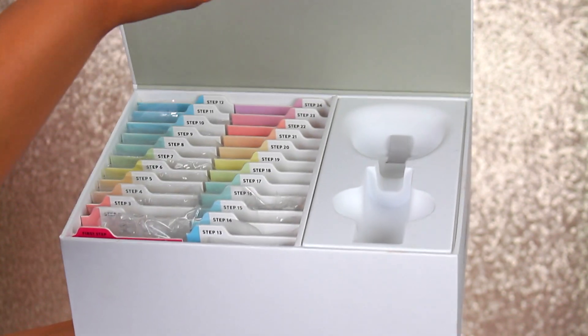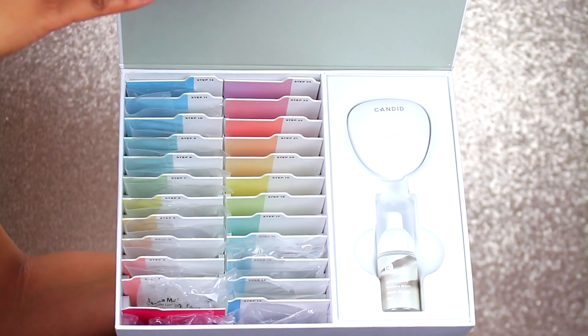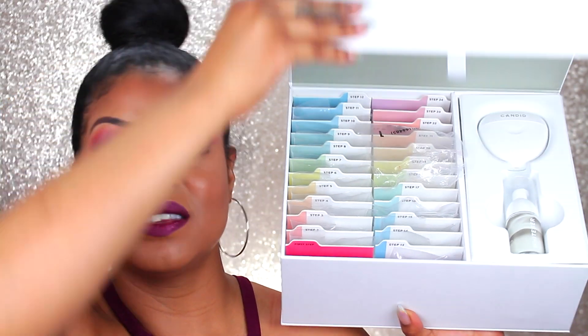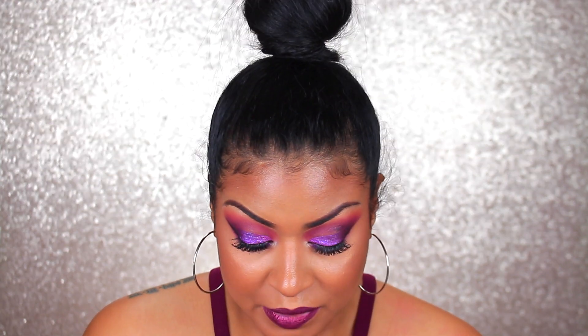So I'm going to go ahead and show you guys what's in the box. Once you open it up, it does fold open and you're going to find all your aligners there. You're going to find the whitening foam as well as the container to hold your aligner when you're not using it. I have 16 steps to complete my journey with Candid, so it's going to take me approximately eight months to complete this journey.